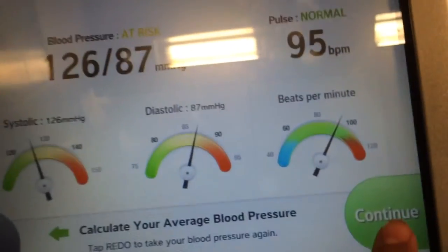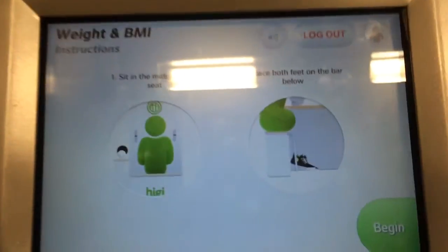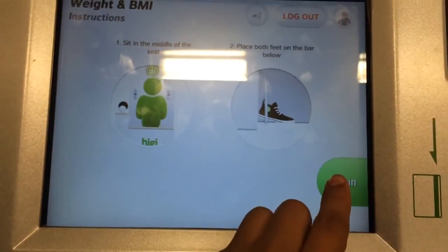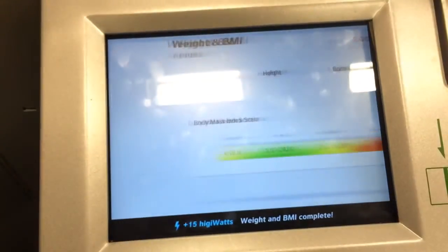Now time to check my weight. Let's check your weight. Sit in the middle of the seat. Place both feet on the bar below. Press begin to get started. Here are your results.